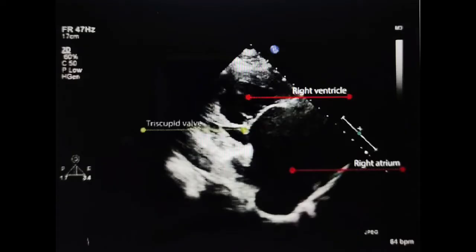The modified parasternal view is called the RV inflow view, in which you can see the right atrium and the tricuspid valve apparatus. In pulmonary hypertension, the RV apex is hypertrophic, the cavity is dilated, and the basal diameter of the RV should be more than 40 to 54 mm. To obtain this view, tilt the probe slightly downward.